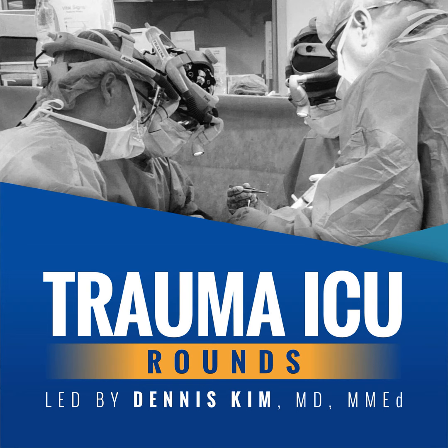And the plateau pressure is obviously one of those key measures that we follow in patients with ARDS. And our goal in these patients is to keep the plateau pressure less than 30 centimeters of water in order to avoid ventilator-induced lung injury in the form of volutrauma, barotrauma, and/or biotrauma. So what if we deliver an 8 cc per kg tidal volume to a 60 kilogram male with ARDS? And at the end of the delivery of the 480 cc's, we perform an inspiratory pause and the plateau pressure comes back as 35 centimeters of water.